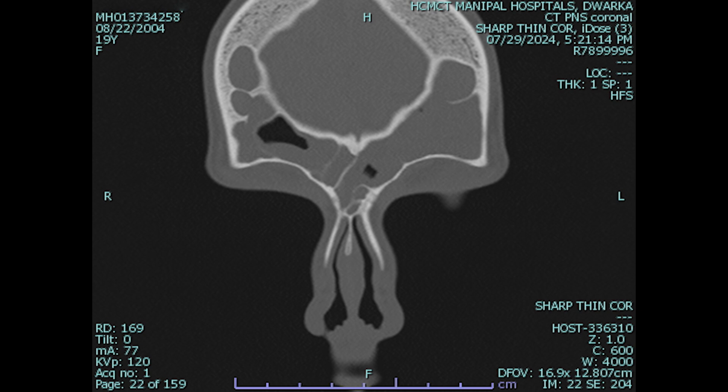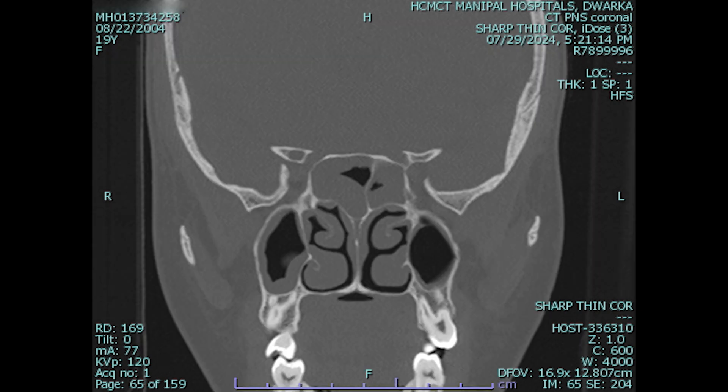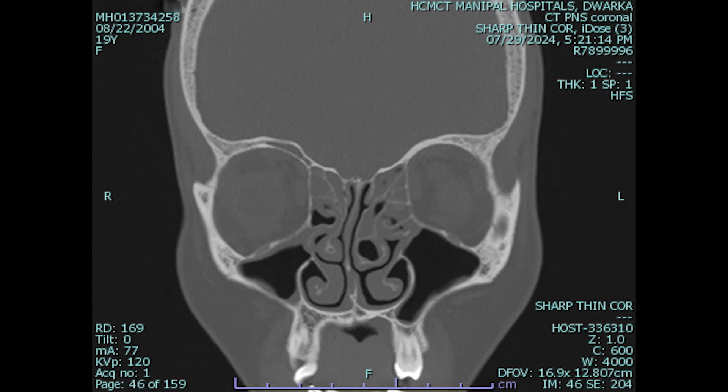The frontal buller cell is a cell that pneumatizes from the ethmoids inside the frontal sinus or recess, often mistaken as an isolated frontal cell. Here, there is also sphenoid sinusitis along with some maxillary sinusitis, and the ethmoids are also involved in the sinusitis.